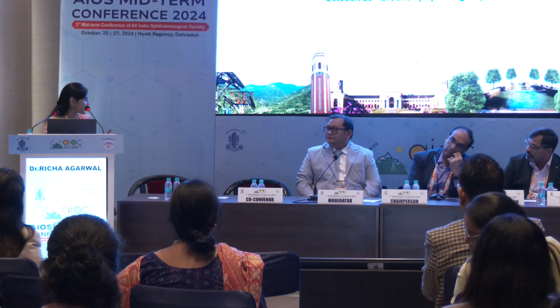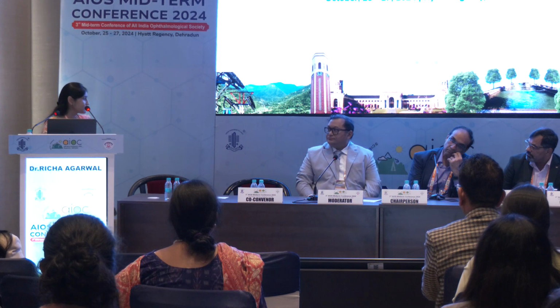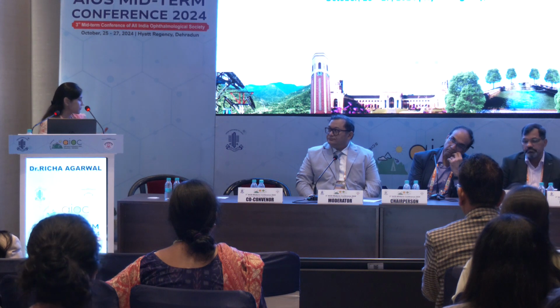Another interesting thing which I saw was with Kane, one of the 5 parameters was gender. Yes, sir. So how does gender come into the picture in the entire formula? I tried to read it in detail, but I couldn't find it. But I think because of the anatomy of the eye, the relation between the anterior chamber and the axial length, that is because of the correlation.